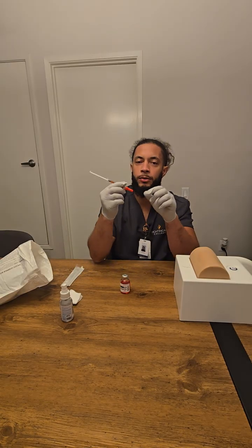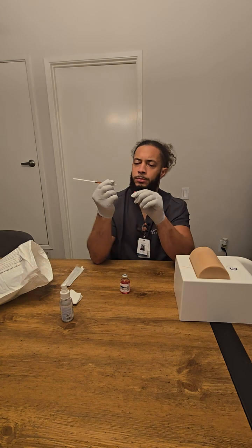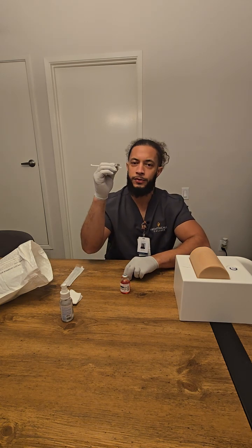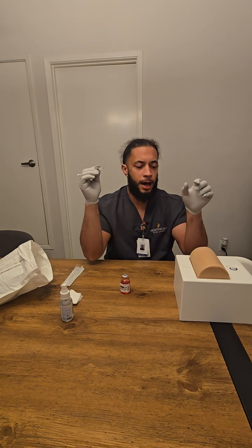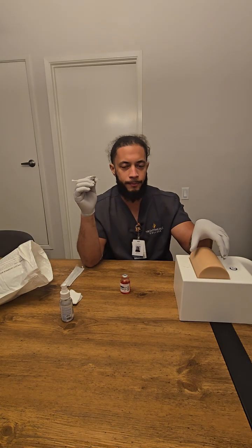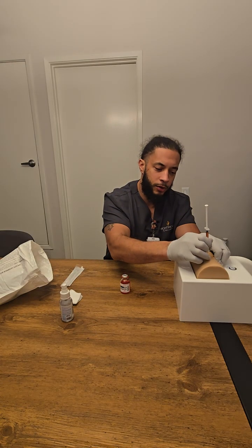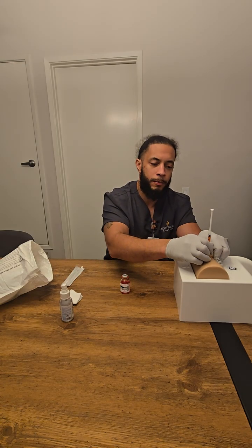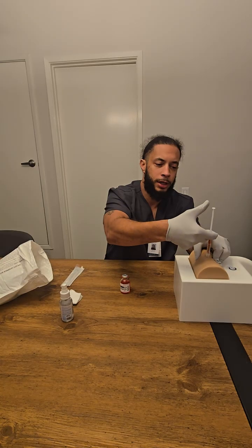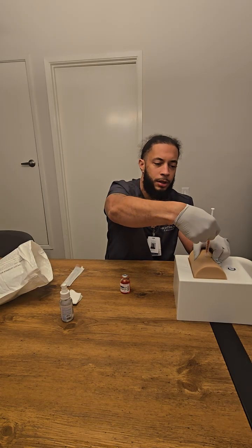Then we take our needle and hold it like a dart with our 2 fingers. Now the skin is dry. We're gonna go in at a 45 to 90 degree angle, and we maintain it and insert the needle.